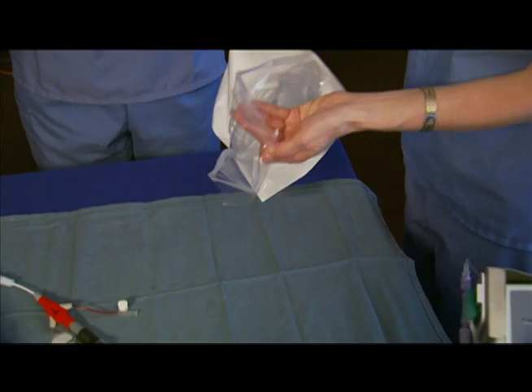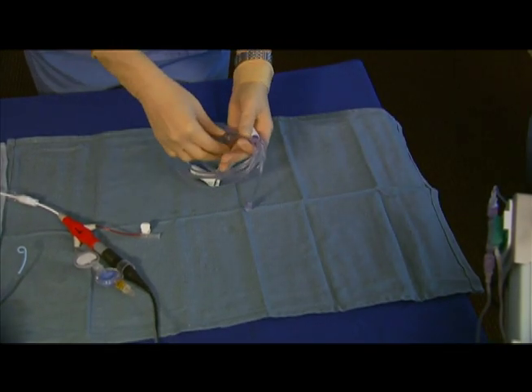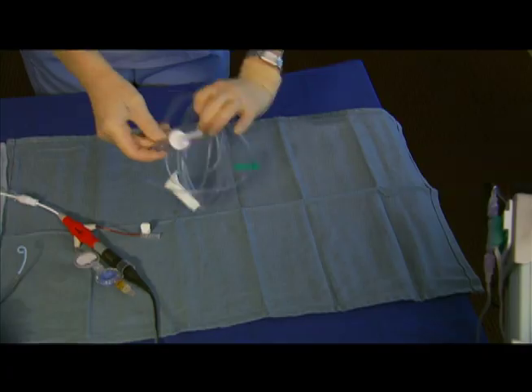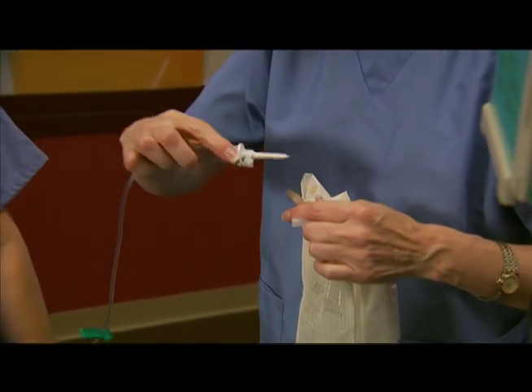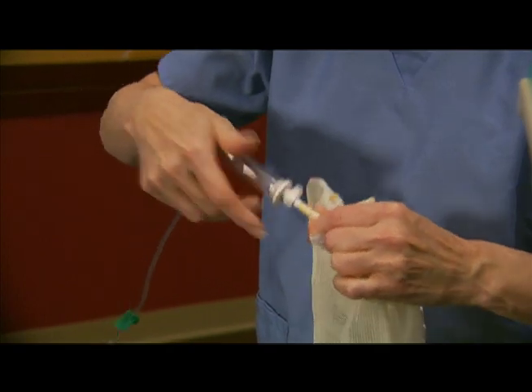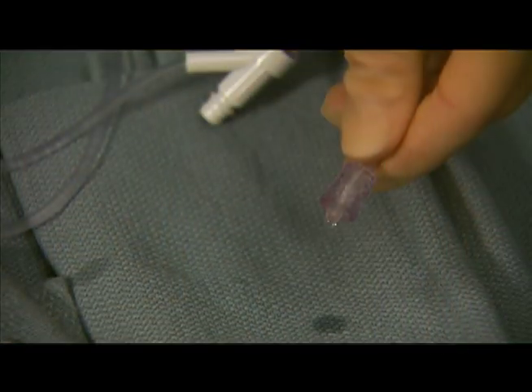Open a sterile solution set and place it on the sterile field. Hand the proximal end of the tubing off the sterile field. Insert the tubing into your standard arterial line solution, for example, a 0.9% sodium chloride infusion bag, and prime the set.